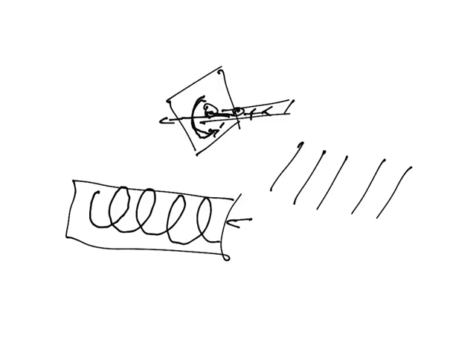So this was clear. I hope you learned a little bit and got kind of a feel for how the technology has improved. And of course, like I said, this is basically the standard of what we have. You go to the hospital, you need to get a CAT scan. That's the kind of machine it's going to be. It's going to be continuous. You're laying on the bed. The machine turns on, it spins around.